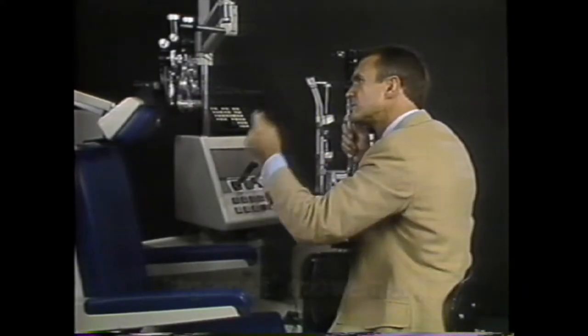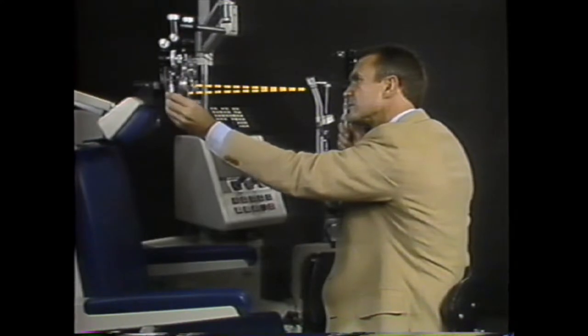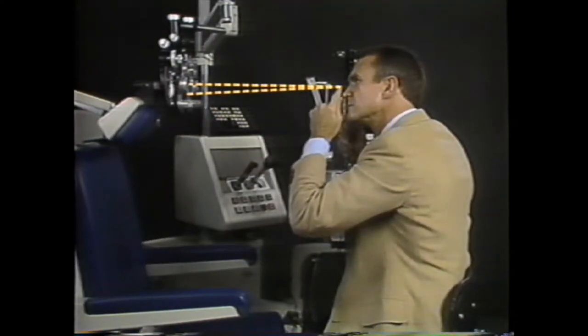If you see against movement, the far point is between the phoropter and the retinoscope, and the lenses are changed in the minus direction by dialing up to move the far point out to the retinoscope.